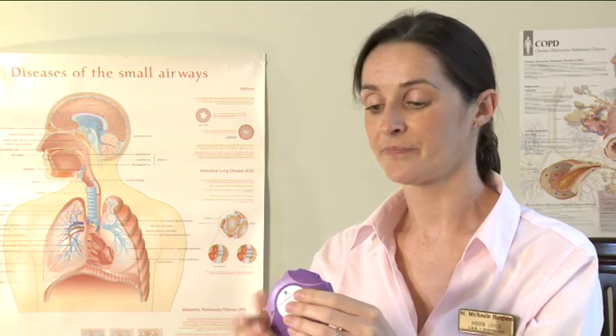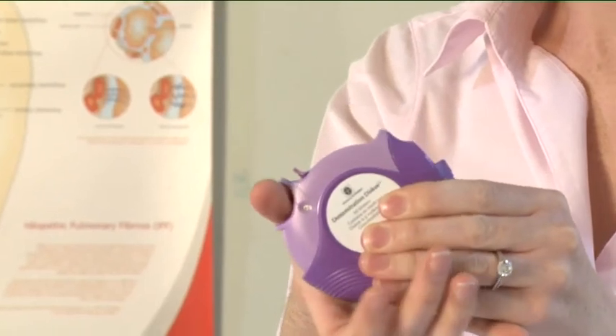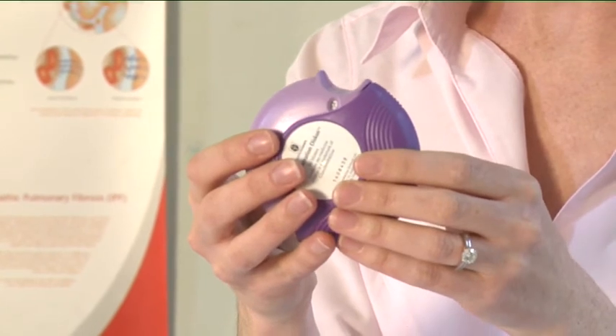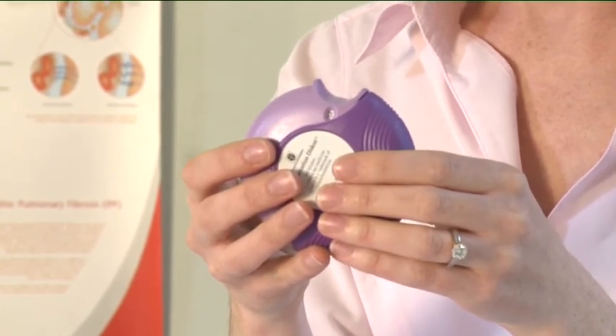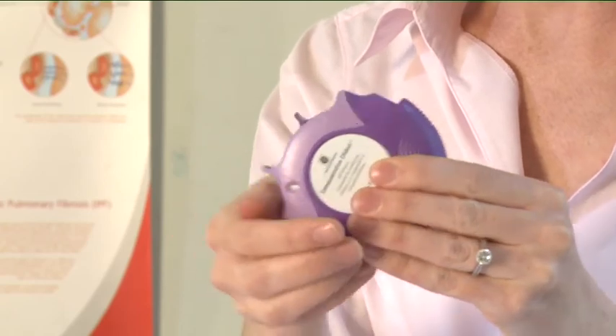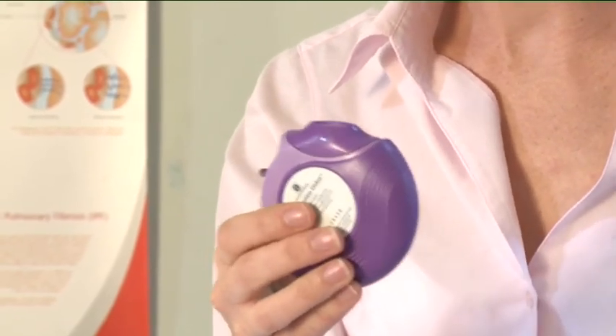To close the discus, slide the thumb grip back towards you as far as it will go. You will hear a click. The lever will return to its original position and is reset. Your discus is now ready for you to use again. To clean, wipe the mouthpiece with a dry cloth or tissue after use.